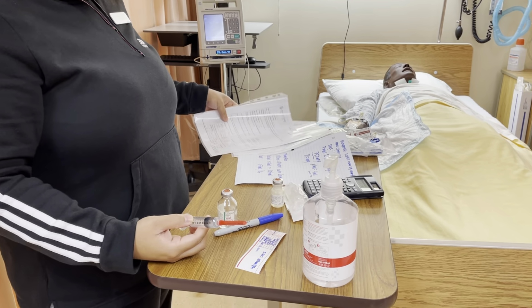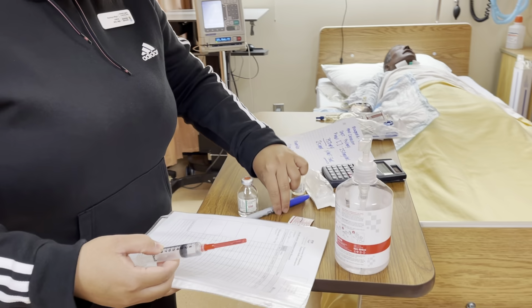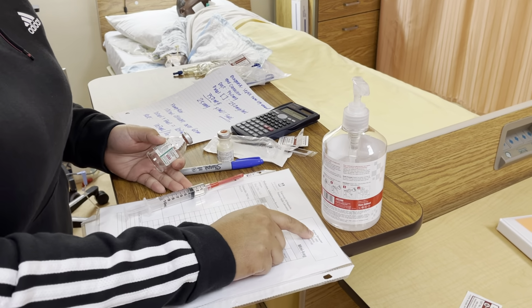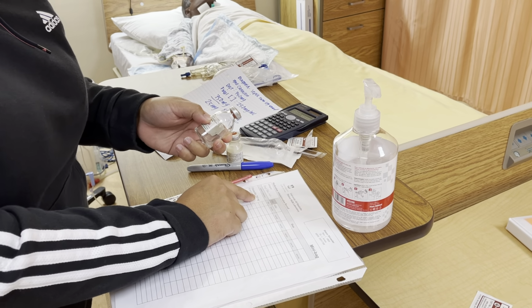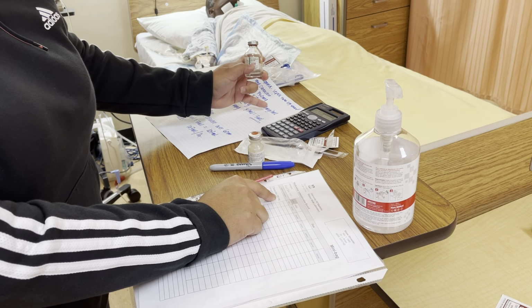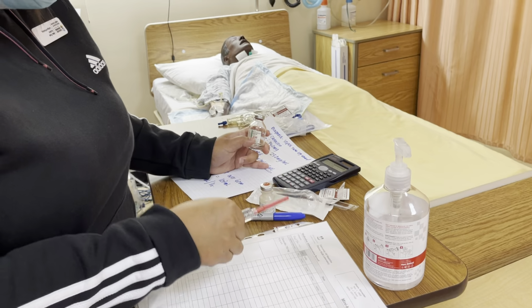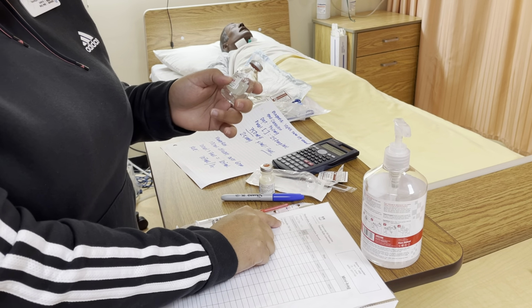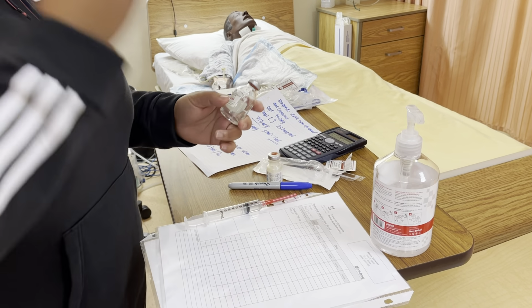So now we'll do our second medication check. Looking at our MAR, we're looking at our patient, Shane Shredder, and the drug is Cloxacillin. The dose is 750 milligram. The final concentration was 250 milligram per ml, so I need 3 ml, and I have 3 ml in my syringe. The route is IV, this is for injection, and the frequency is every 4 hours. And then it's due now.